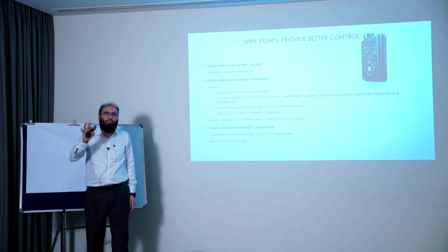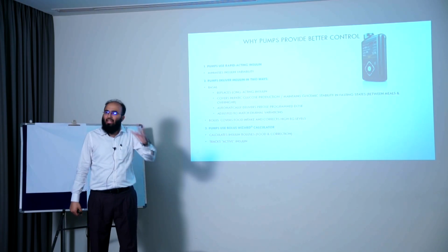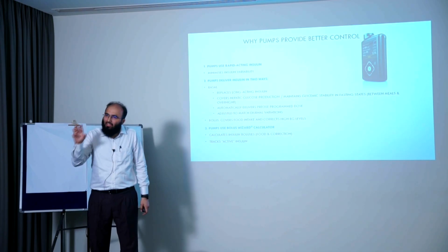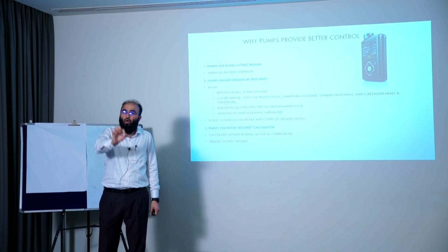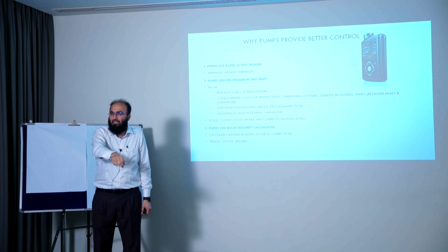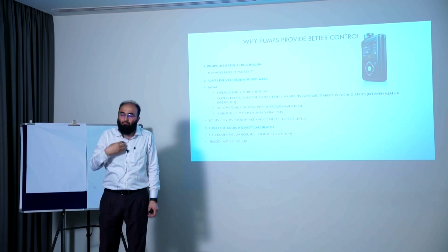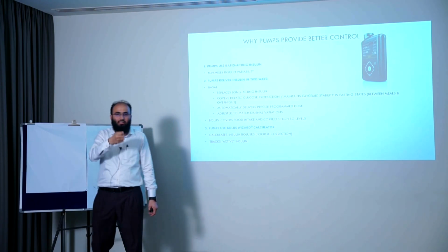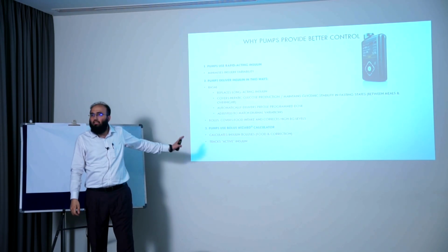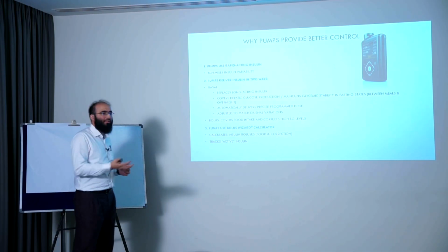Now, my question to you is, why have these become a reality? The pain point was that there is glycemic variability in each individual, and for the same individual there is variability on a day-to-day and intra-day basis. So it is very difficult for us to practically adjust the dosages for each patient. This is what these pumps do. And bolus covers the food intake and corrects high blood glucose levels.